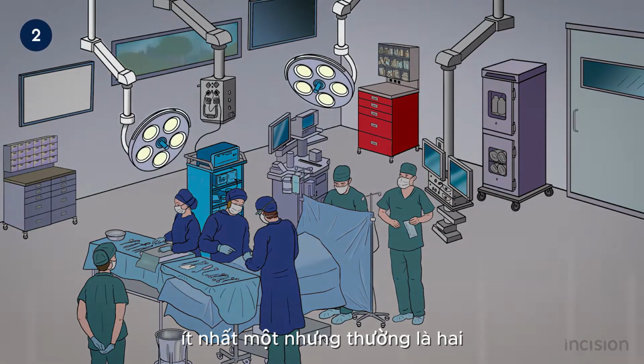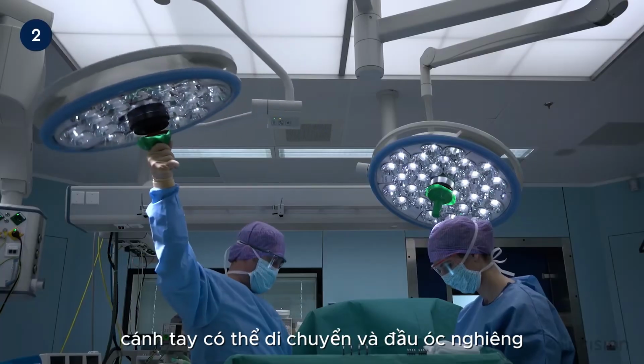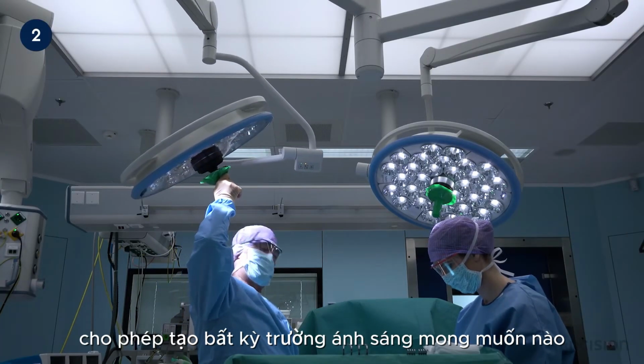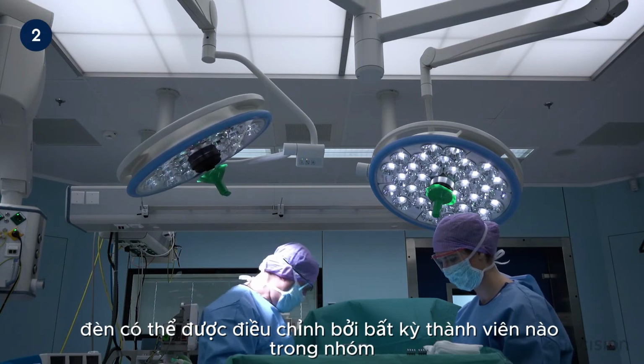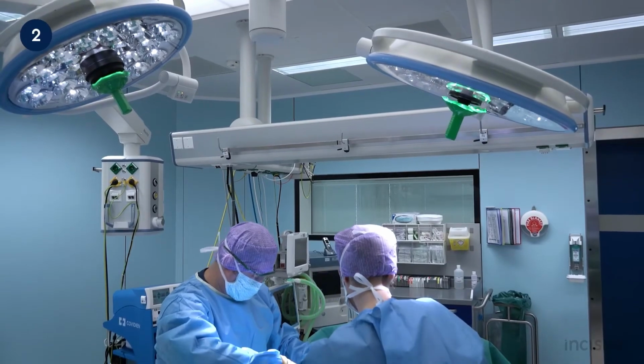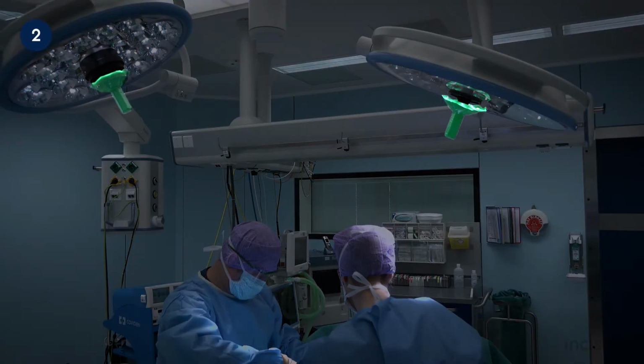At least one, but usually two operating lights are installed above the surgical table. The movable arms and tiltable light head allow for creating any desired light field. The lights can be adjusted by any team member. The handpiece should be covered with a sterile cover.